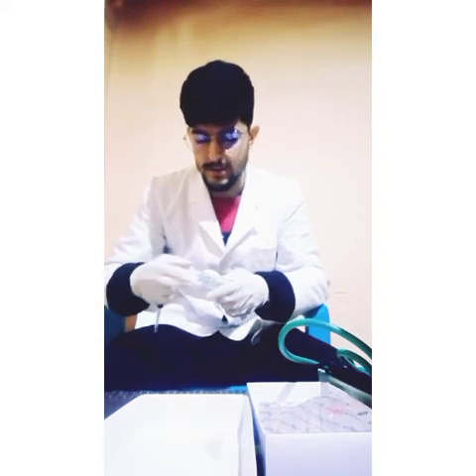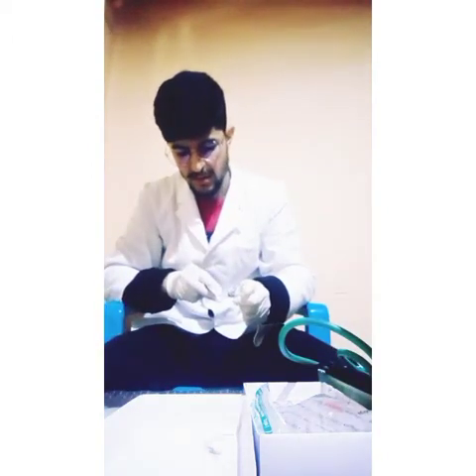We take the packet of the gloves and put it in the medical waste A. Now we go for the syringe. We check its expiry date and cut it open. We put its waste also in the medical waste A. After that we take the medicine: just clean its cap with cotton, dropping alcohol on the cotton and cleaning it. After that we take off the lid and draw the medicine.